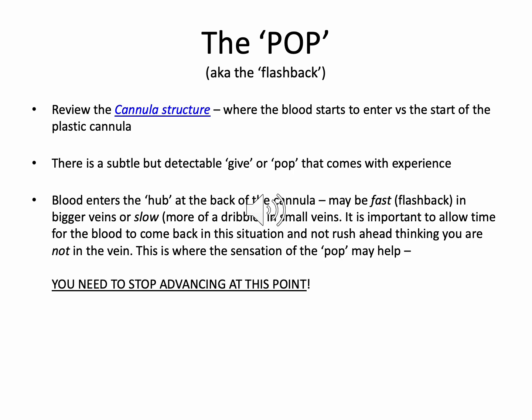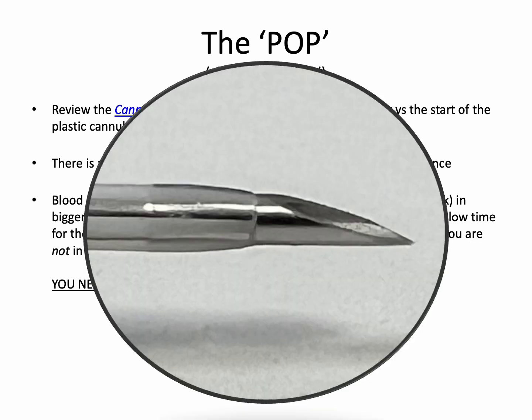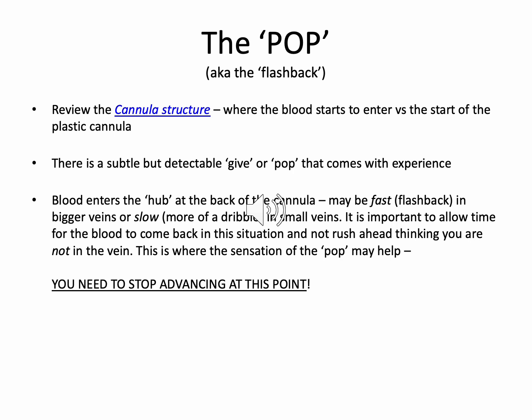Please review the cannula structure, noting that the plastic cannula starts well behind the point where blood enters the needle. There is a subtle but detectable pop that comes with experience. Please note that the rapidity of flashback of blood into the hub of the cannula depends on the size and back pressure within the vein.